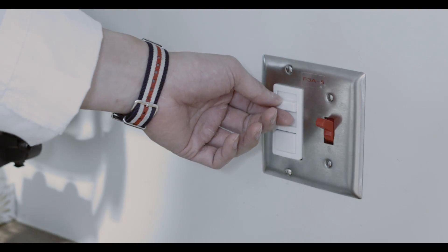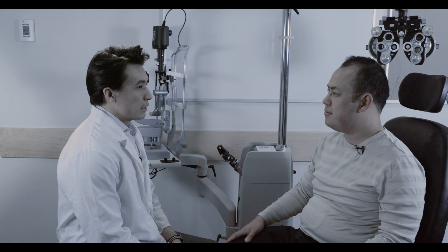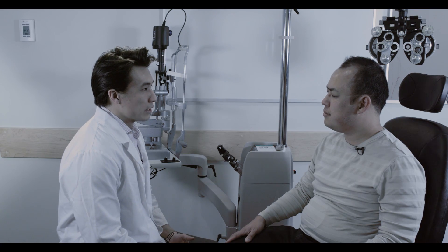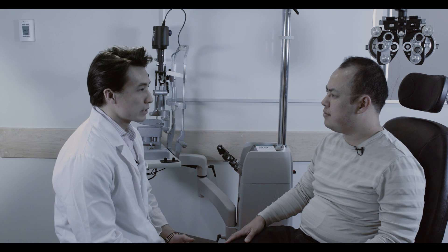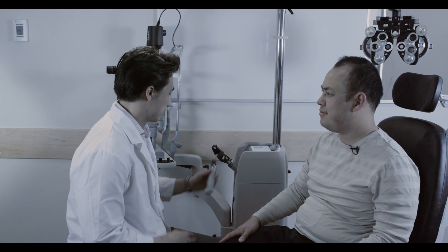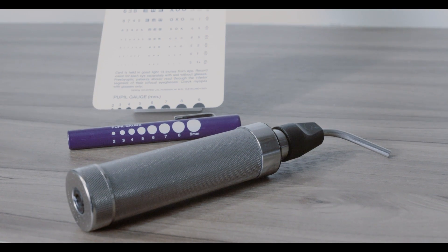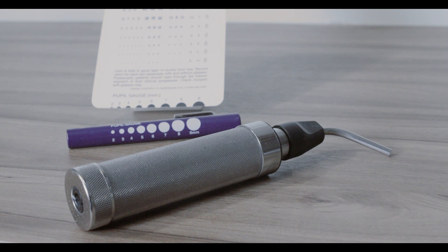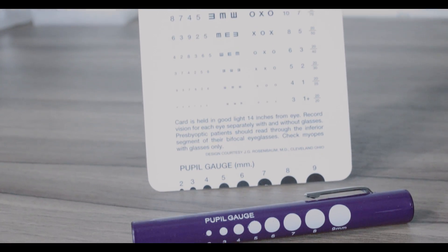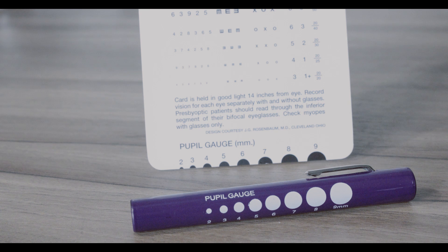First, make sure all lights are appropriately dimmed. The examiner instructs the patient: 'I'm going to be shining a light in your eyes — just do your best to look in the distance as I do this.' A penlight is used to determine pupillary measurements, and a pupil card with measurements or a ruler can be helpful to determine pupil size.